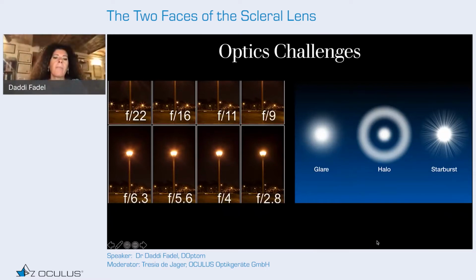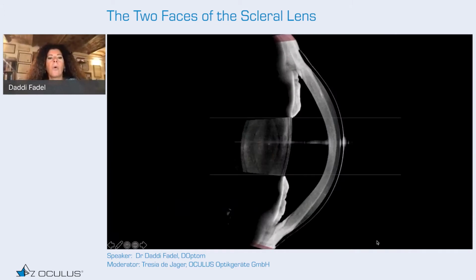Several optical issues may arise, such as glare, halo, and starburst, especially in cases with refractive surgery and advanced keratoconus. So here a customized anterior surface is needed. The customization of an anterior surface optic requires a well-centered lens, thus a perfect alignment with the conjunctiva, and high lens stability on the eye. Therefore, the back surface is crucial not only to align with the conjunctival tissue and avoid problems, but also to allow success in the customization of the anterior surface and for a better quality of vision.